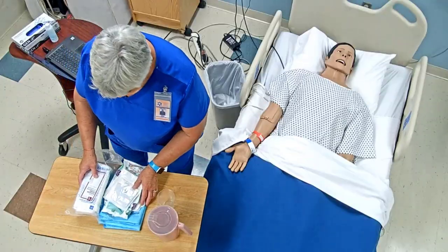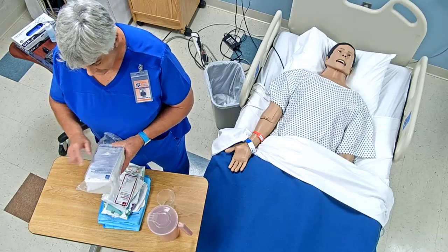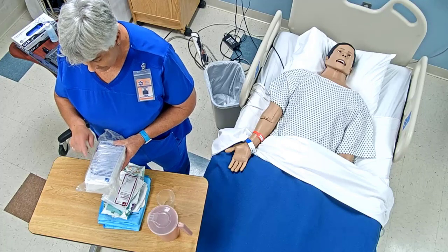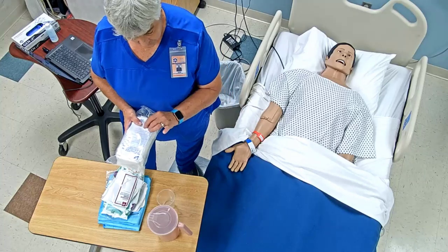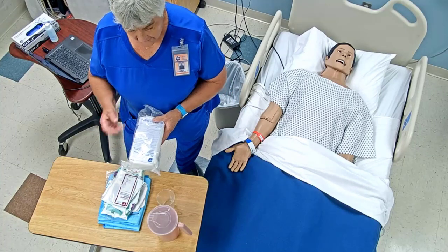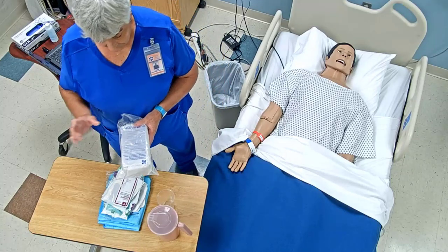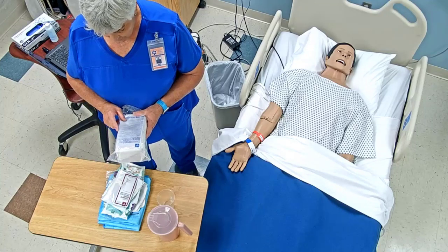And in the supply room, I'm going to make sure I get my kit, okay? This is a pre-connected urethral catheterization tray and bag. That means there's a bag in here connected to the tubing, so that's where the urine will collect. Since I'm doing a UA-CNS, I will collect the specimen from the bag once I've finished the procedure.